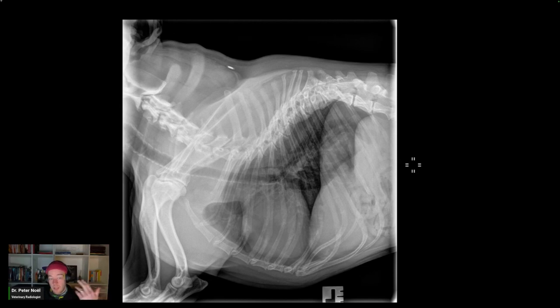Differential diagnosis would be, in this case, it was from just, he can't breathe, right? He can't walk, he can't breathe. And so it's just pulling that up. And so he's got this sliding hiatal hernia.